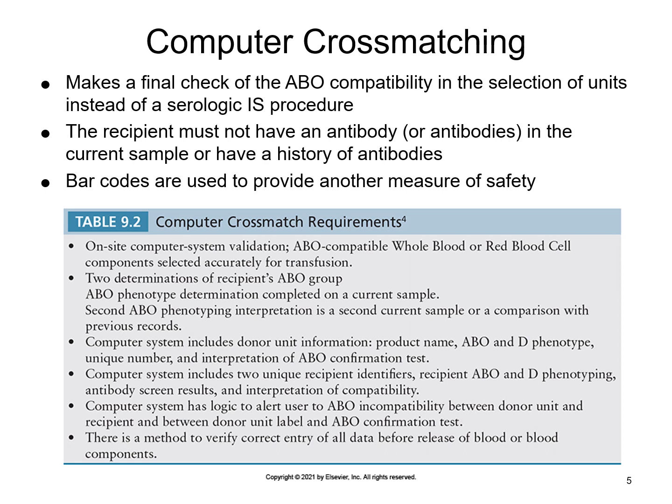And what they'll actually do is, if they do the patient's history and there's no type on file, then they'll enter that blood type. If it's any type other than O, because if it's an O patient you're going to give them O anyway, which is considered your universal, so if they're another blood type other than O, then you would order that recheck and get a second stick. Some facilities will actually use, like if there's a CBC that was drawn at a different time, that CBC sample to do that blood type recheck, and it just saves the patient a stick.